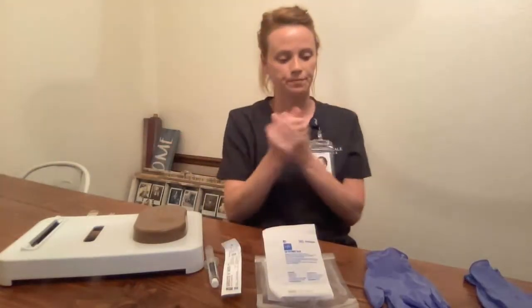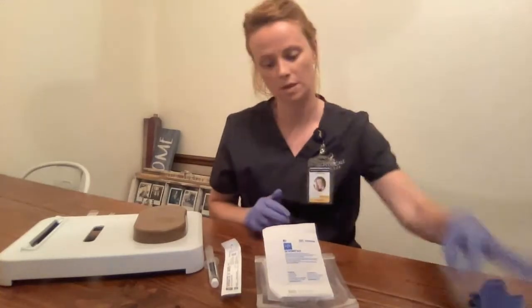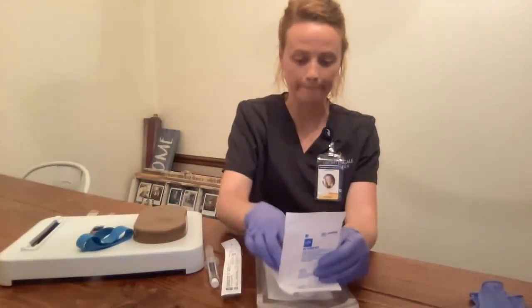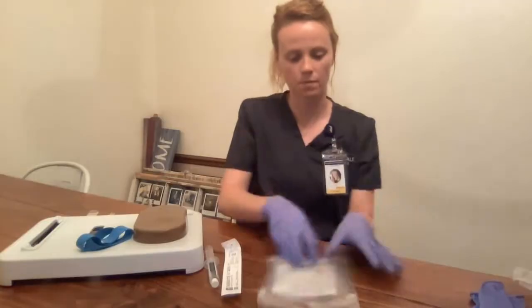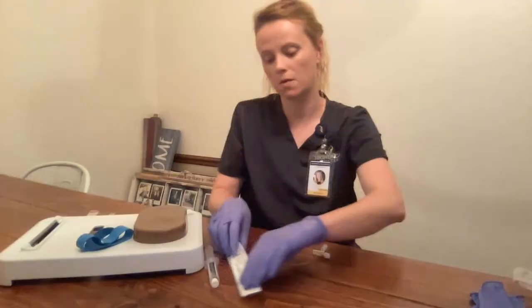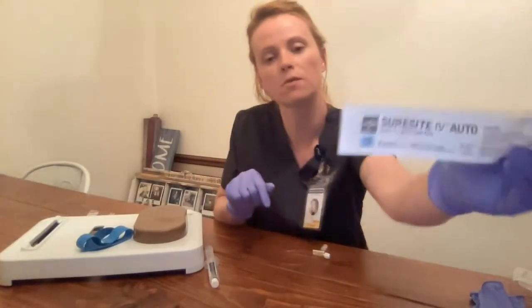I'm going to come over here and do hand hygiene. I'm going to get everything set up. My patient here, Mrs. Smith, is an elderly patient. She came in to get some IV fluids, so she's going to get a 22-gauge, 1-inch needle.